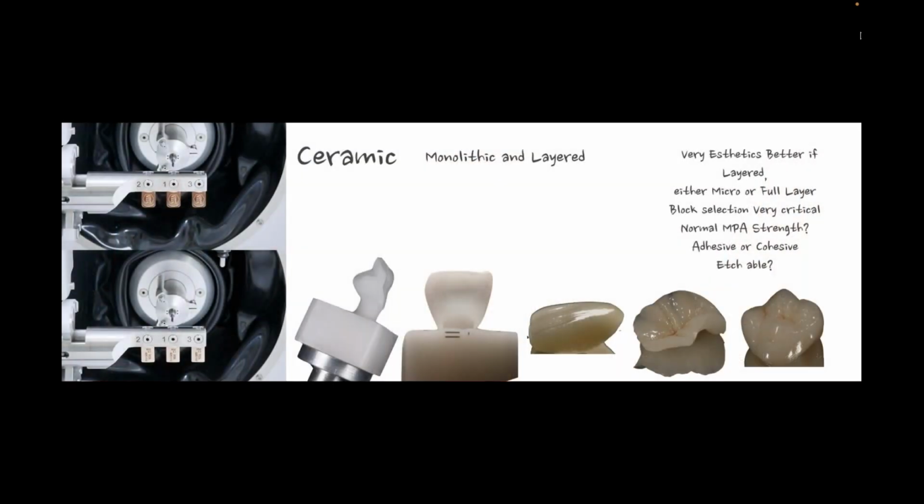And it worked out pretty well. But remember how difficult that is, because all it was 2/10 to about 4/10 of a millimeter, which means I had to do it all with enamels. And how I created that filter became much more challenging for me to work through the process. So there was a good learning curve on this case. And I want to be clear that the learning curve was, this was a case that I had to utilize accent stains and other stain materials to give me the effects I want, because I had no real space to do anything else to work in with Mamelon materials or other colors.